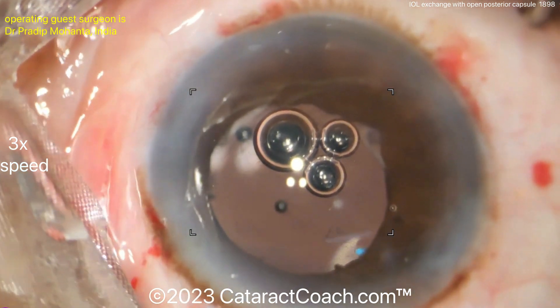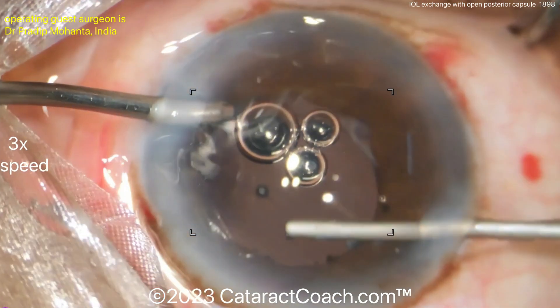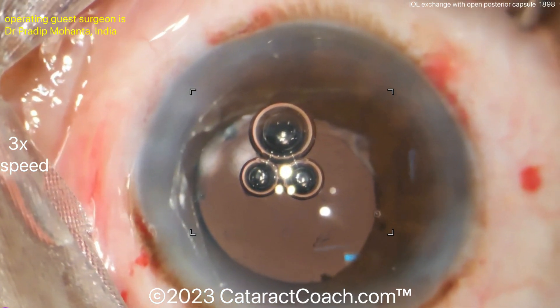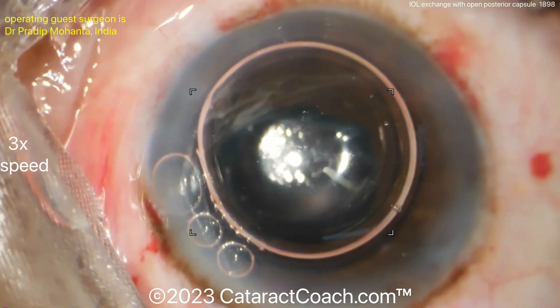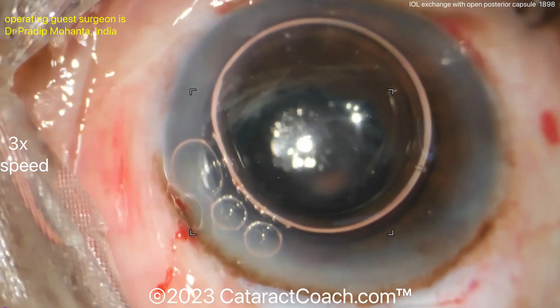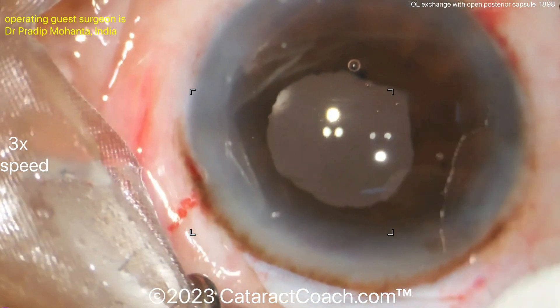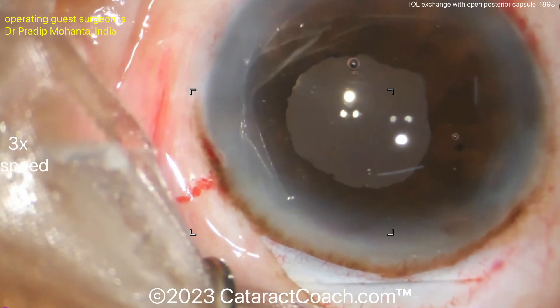Thank you to Dr. Mohanta for his great teachings here. At the end of the case there's a little vitreous visible going toward the incision where the triamcinolone stains it. Being meticulous and taking your time to make sure everything is as you want it is really the right approach. A suture will go in for that larger incision — at least that's the approach in most hands, though Dr. Mohanta may do without.